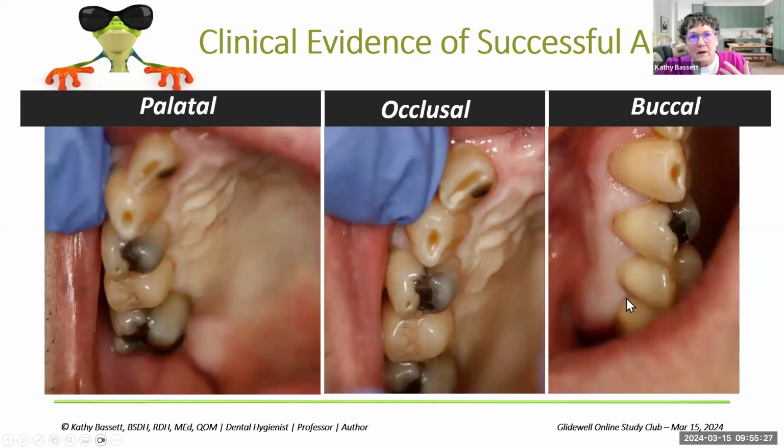And then here on the buccal, by the time I gave 2/3, 3/4 of a cartridge, and then lifted up the lip in that approximately 2 to 3 minutes, you can see the diffusion clear through to the buccal. Now I have pulpal, buccal gingiva, and palatal soft tissues all anesthetized, but I don't have any interference in the facial tissues above that.